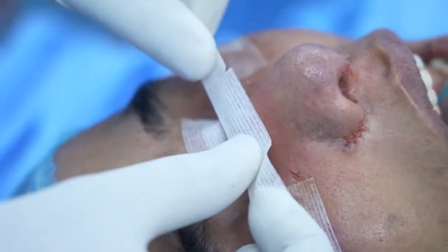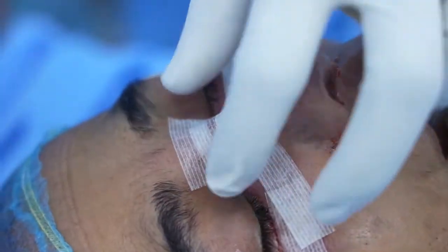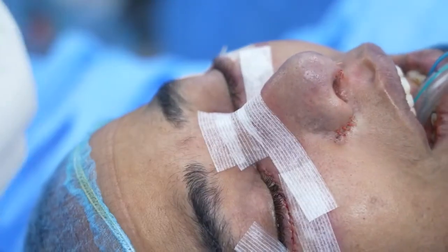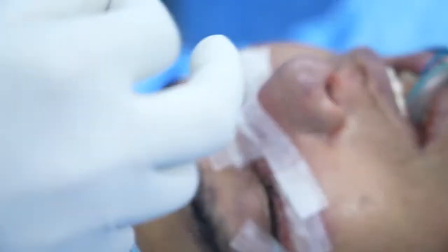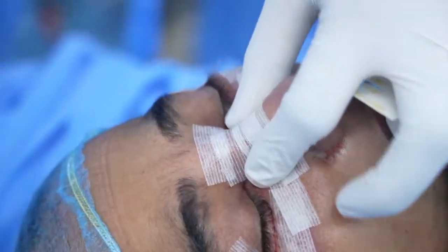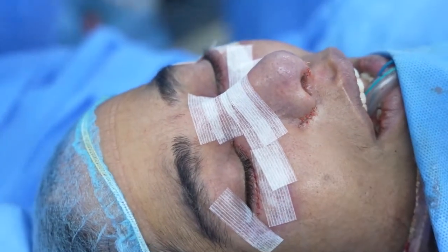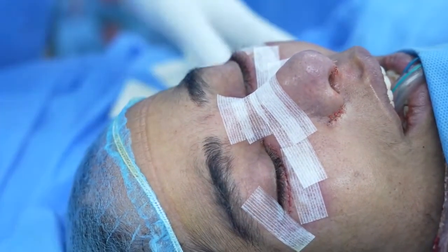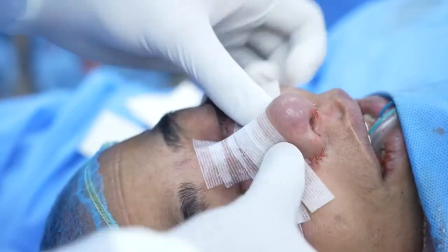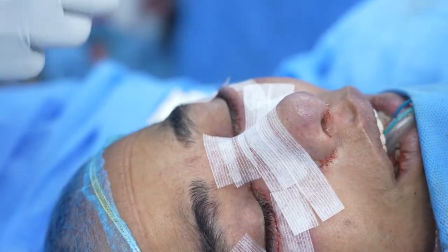Also we had to fix various issues on the inside of the nose that had to basically do with the asymmetry on the basal view. We're going to show you that as well. Steri strips. Didn't do any septal work for this patient. It wasn't needed. She had good septal support and also no issues with breathing.